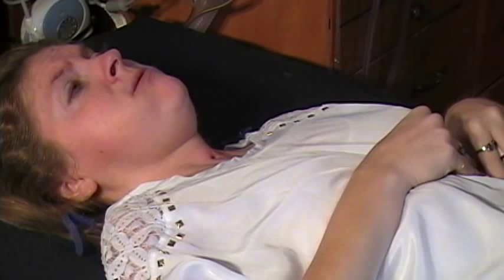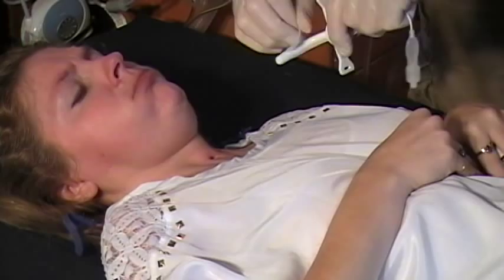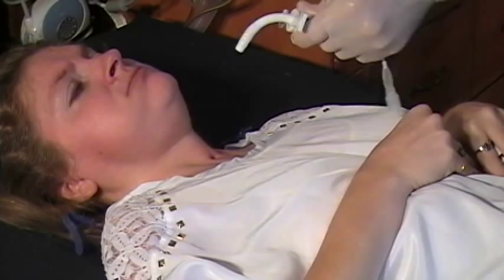Usually I'm fast enough to get this done before the vent alarm beeps, but I'm being slow today. You silence the alarm. Now I'm applying sterile lubricant to the shaft of the tube, being extra thorough today.